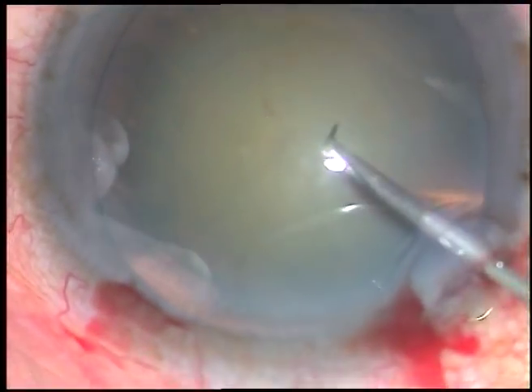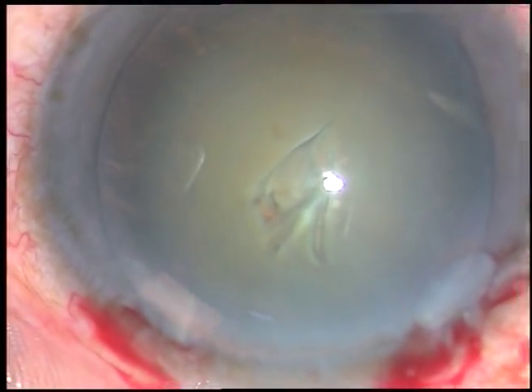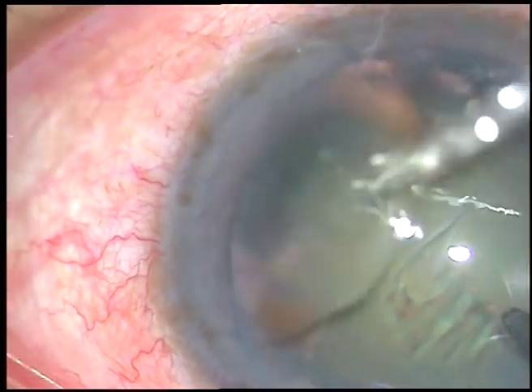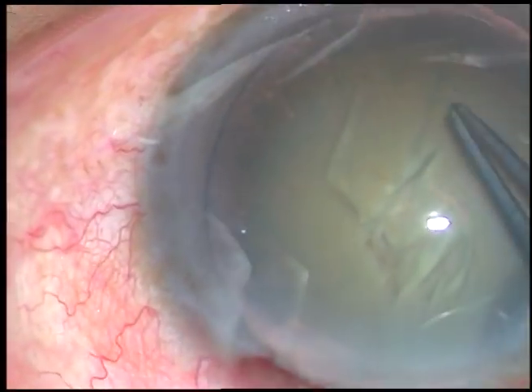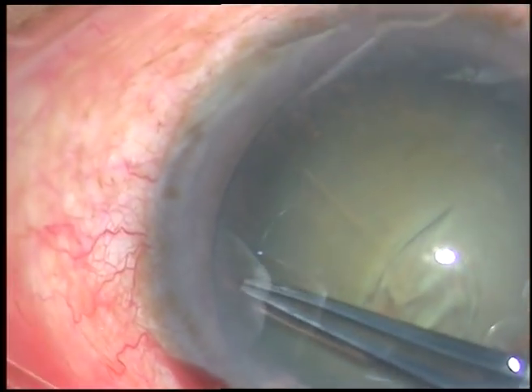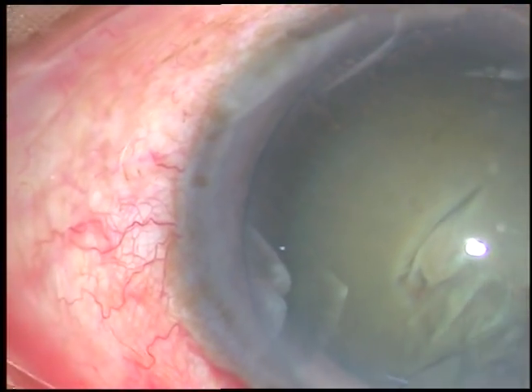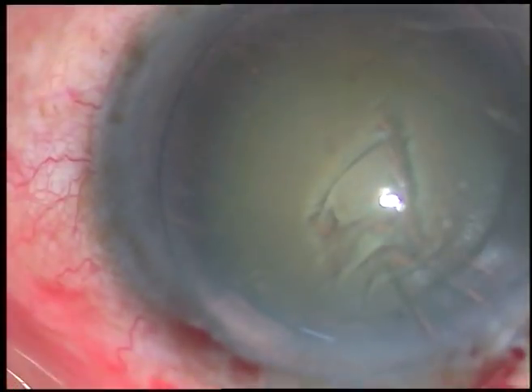Now capsulorhexis is to be done. I incise the anterior capsule with a 26-gauge bent needle, raise a big flap, and hold this flap with Utrata forceps. Now I go anticlockwise. When I reach 6 o'clock, the capsule tended to go to the periphery, but I could easily bring the rhexis back on track and complete it. It was an adequate sized rhexis.